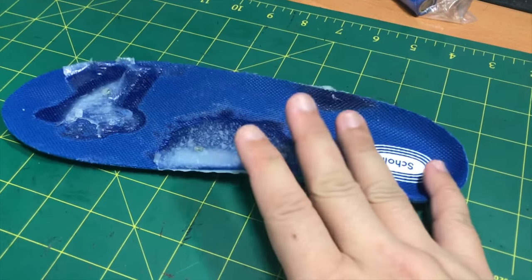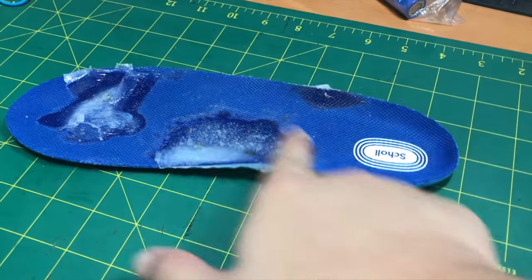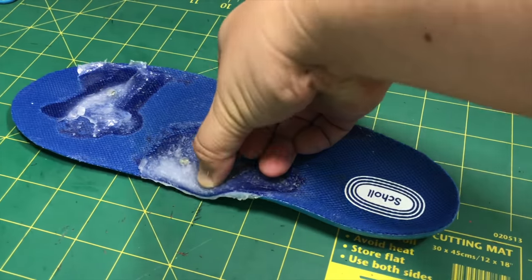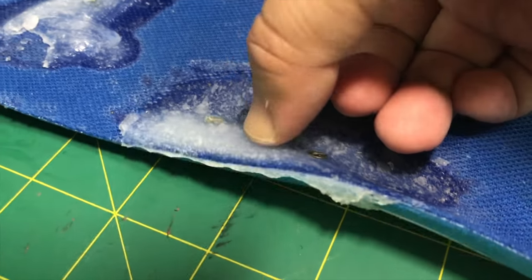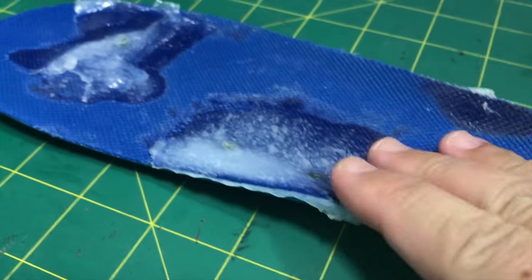This is the result of the DIY custom insoles that will support your arches. For my arches, it's a little bit low because I'm a flat foot. You can see that it's very very soft to touch — it's actually very very bouncy. Very very nice. It's firm and it will not go anywhere.